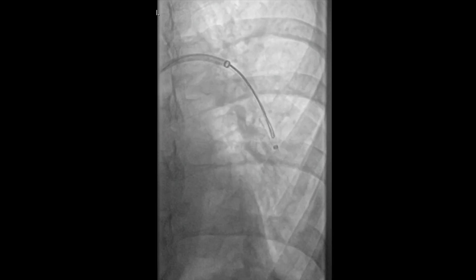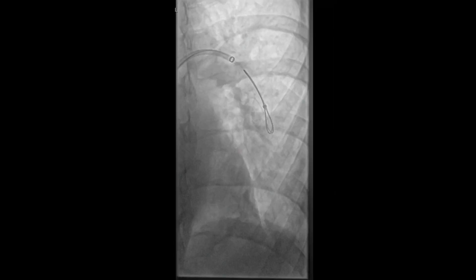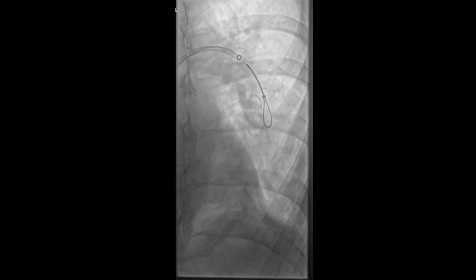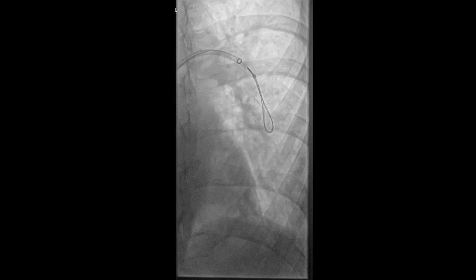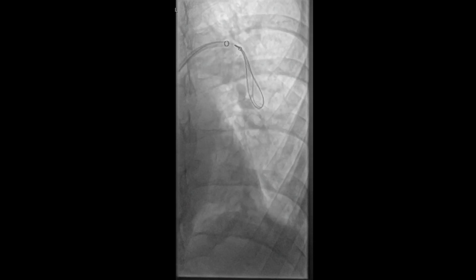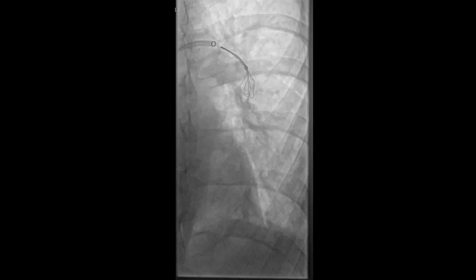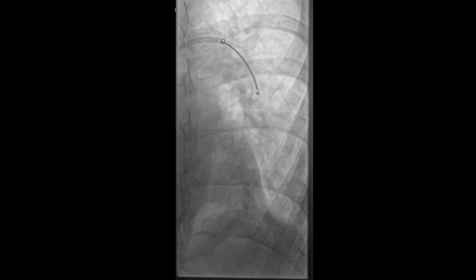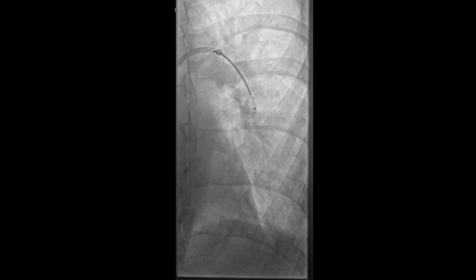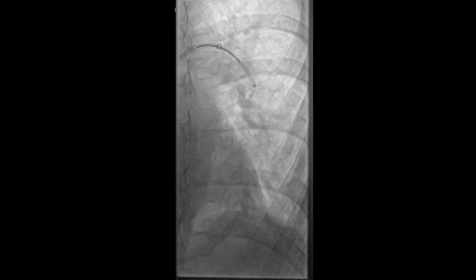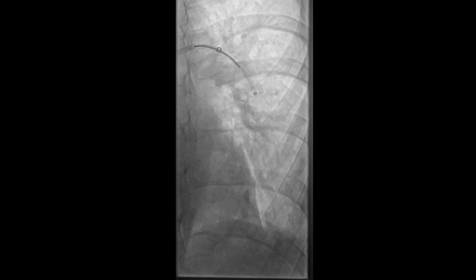Next, we advanced our ensnare into the left lower segmental pulmonary artery. The wire fragment was then captured in the ensnare and withdrawn into the sheath as shown here.